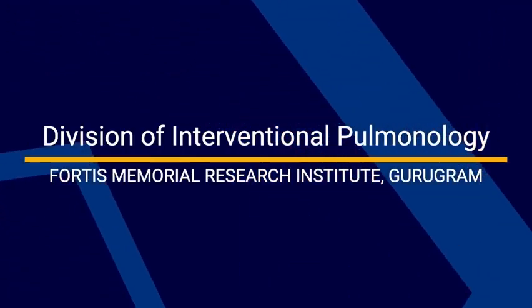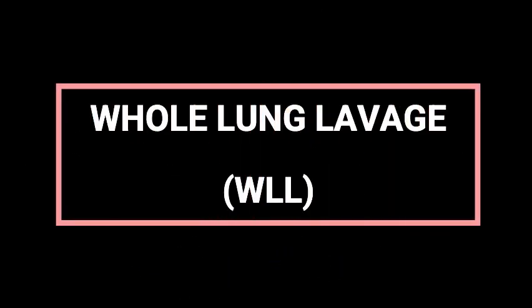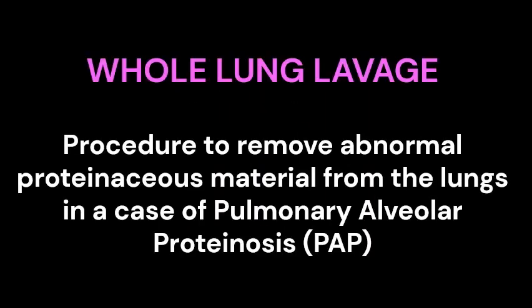Division of Interventional Pulmonology, Fortis Memorial Research Institute, Guru Gram. Whole Lung Lavage is a procedure to remove abnormal proteinaceous material from the lungs in a case of pulmonary alveolar proteinosis, also referred to as PAP.